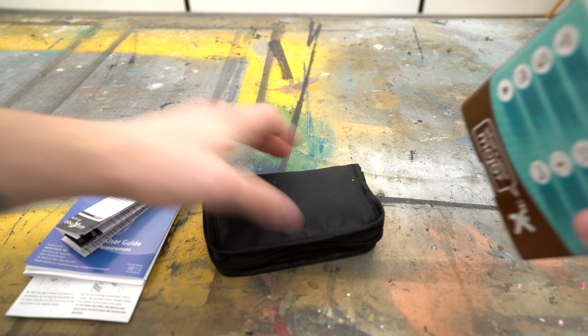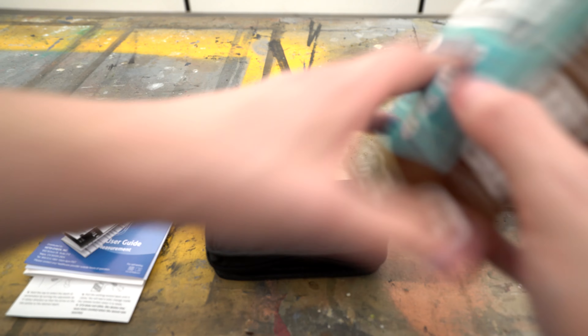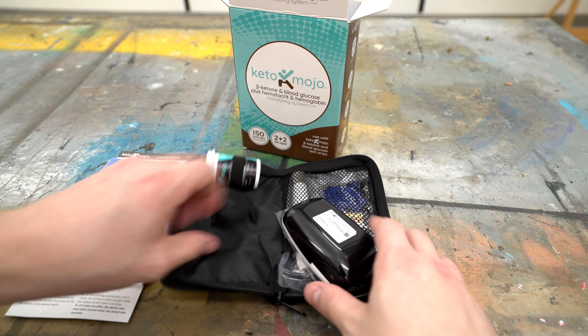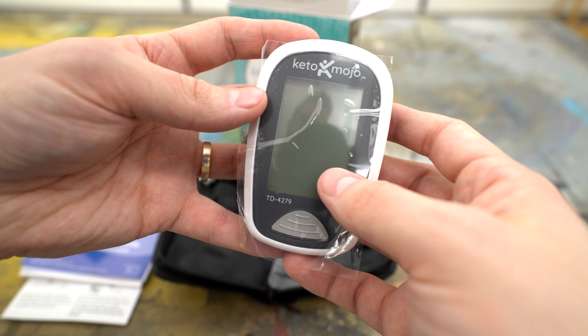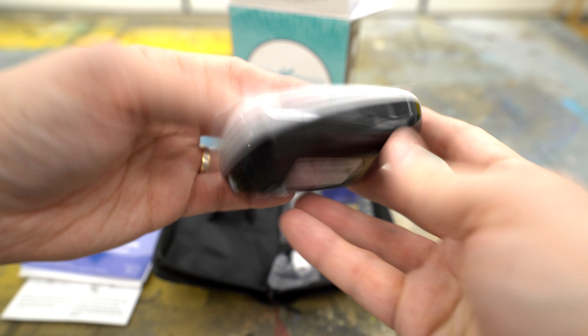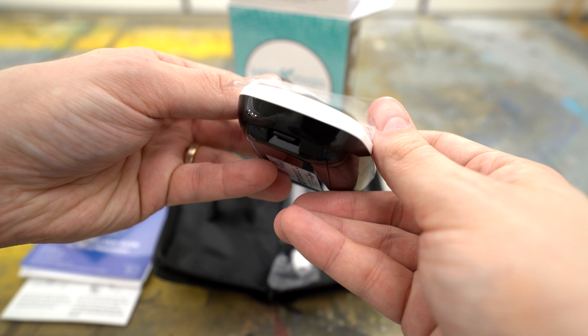It also comes with a little travel case, which is nice to have so you can fit the lancet, extra lancing devices, the meter, and the actual testing strips — they can all fit conveniently in this little case. Throw it in a backpack, take it with you — nice and convenient.